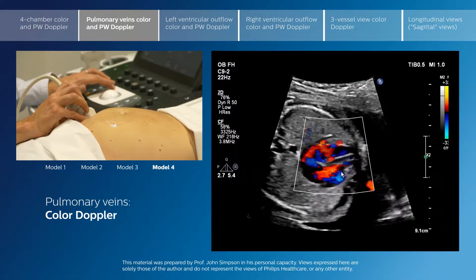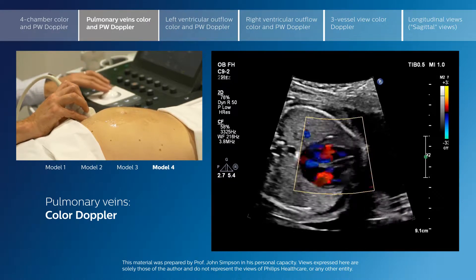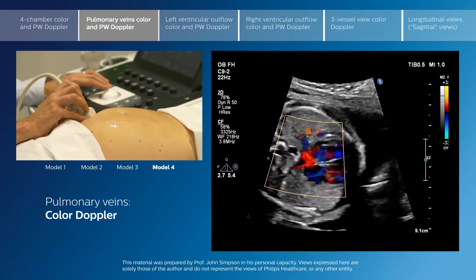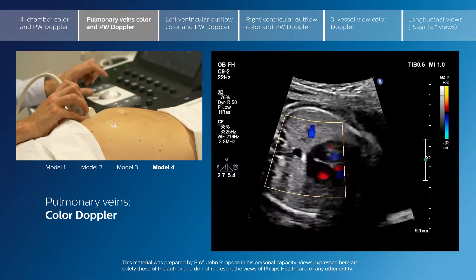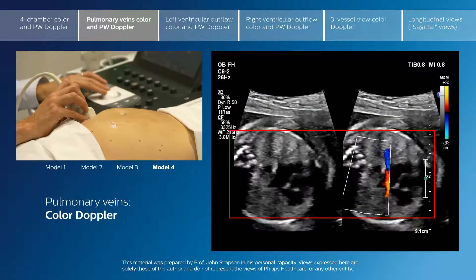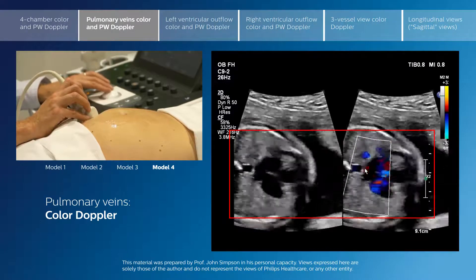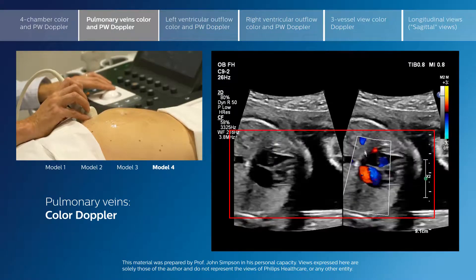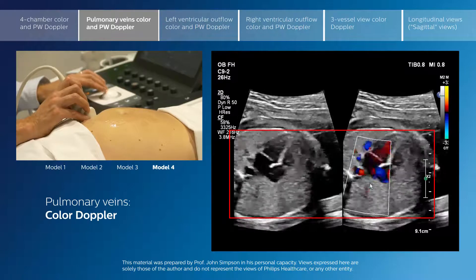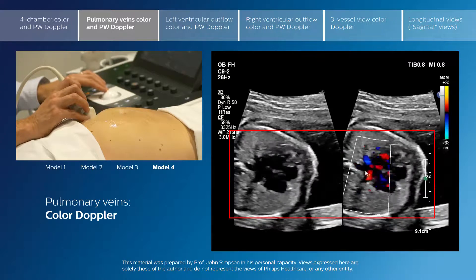I'm now going to sweep the color box back to the level of the pulmonary veins, which enter the back of the left atrium, and I'm going to switch to the color compare mode. We are visualizing the back of the left atrium here, and we're now seeing color flow coming from the left pulmonary veins, and from the right pulmonary veins, back in towards the left atrium.